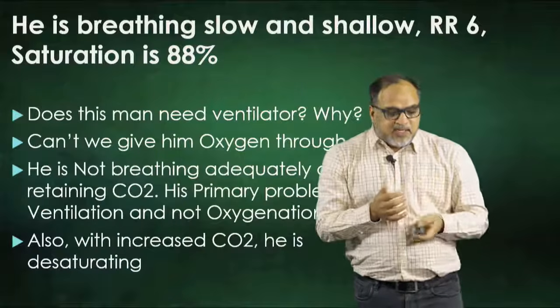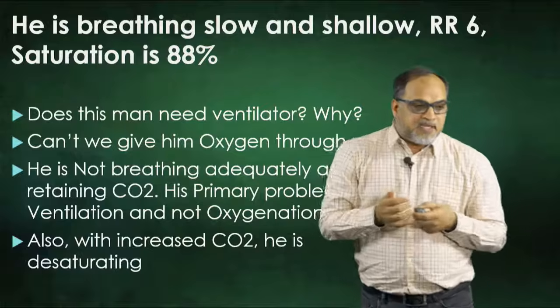And what kind of ventilation? Positive pressure ventilation. So what exactly is positive pressure ventilation? How do we breathe in normal day-to-day life? We breathe in. You must have seen your patients, when you auscultate, you tell them, ek gehri saans lo, take a deep breath in. You ask them to, ek saans khincho.